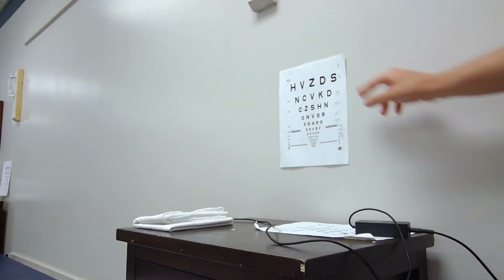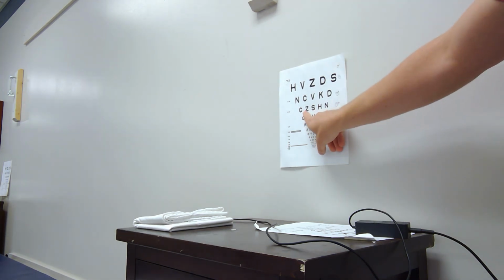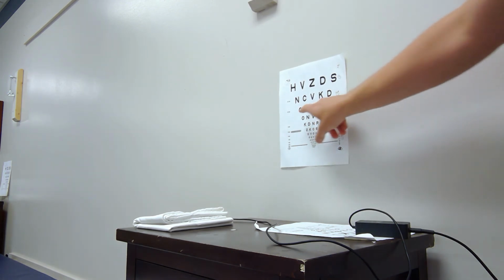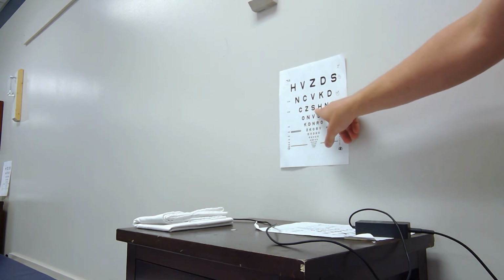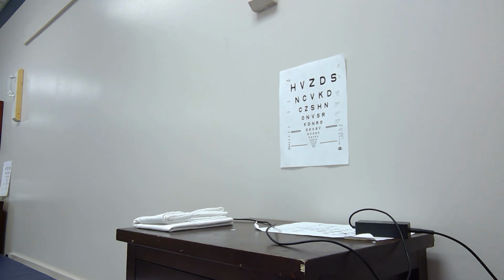The other thing for this test to note, the way we name the line that they're at is the last full line that they were able to read, right? So you can see it in the video. This third one here, if they could fully read this entire line, CZSHN, then great, they got to line 3. But if they only got CZ and then they said W, then we're going to go up to 2 and call that the last line that they read. So that is the dynamic visual acuity test.